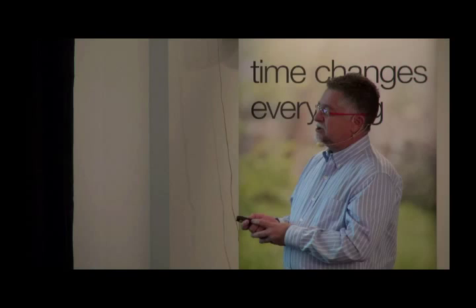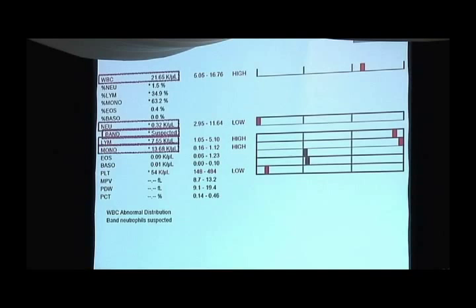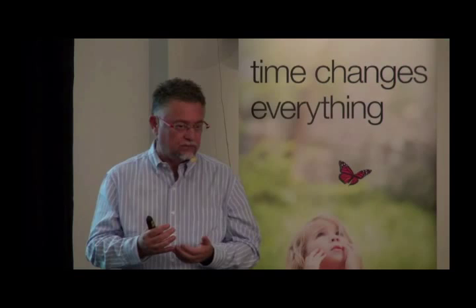Remember we said a sick dog should not have very many lymphocytes because they should have a stress leukogram. But do you notice that next to the neutrophils, the lymphocytes, and the monocytes, there is a little asterisk? That's the second way the instrument is telling you, I don't think they're actually lymphocytes. They kind of look like lymphocytes, but I am fairly sure they are not, so please look at the smear. All right, does that make sense, you guys?